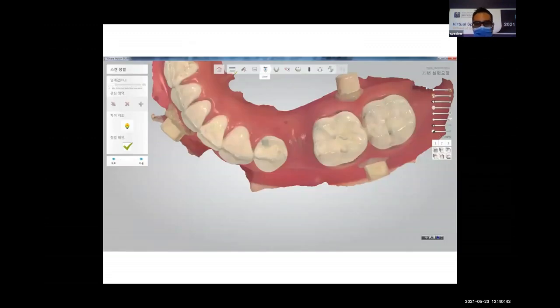Okay, I have to explain a little bit about the differences between the traditional or conventional way of doing implant treatments for patients and the newer way that we call the digital way for implant placement. In the conventional way, as all of us know, the patient at the first session is referred to the surgeon, and the surgeon, after some intraoral examination and evaluating the patient's CBCT, sets the surgical session for the patient.